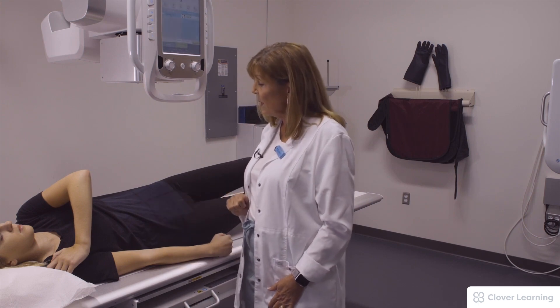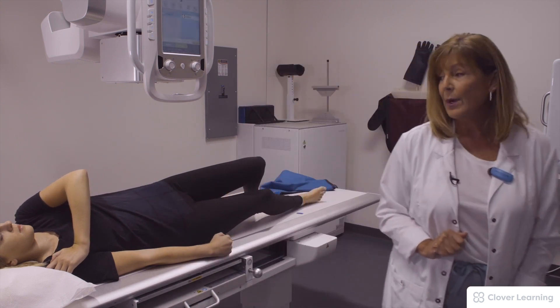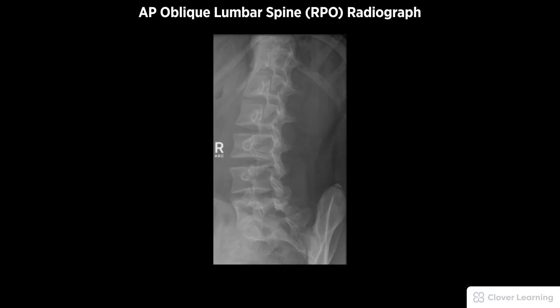Patient, take in a big breath and blow your breath all the way out. Now hold your breath, don't breathe. A diagnostic AP lumbar spine right posterior oblique RPO view radiograph must be free of motion.